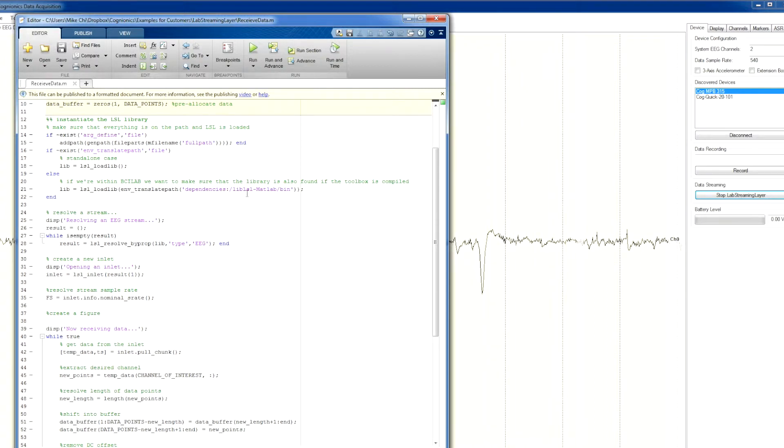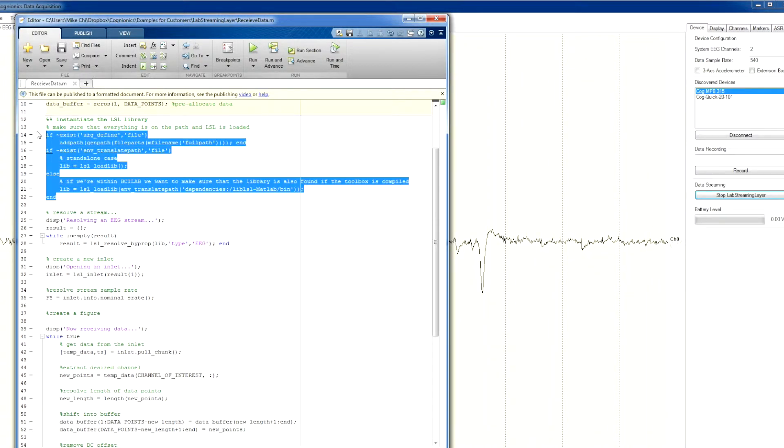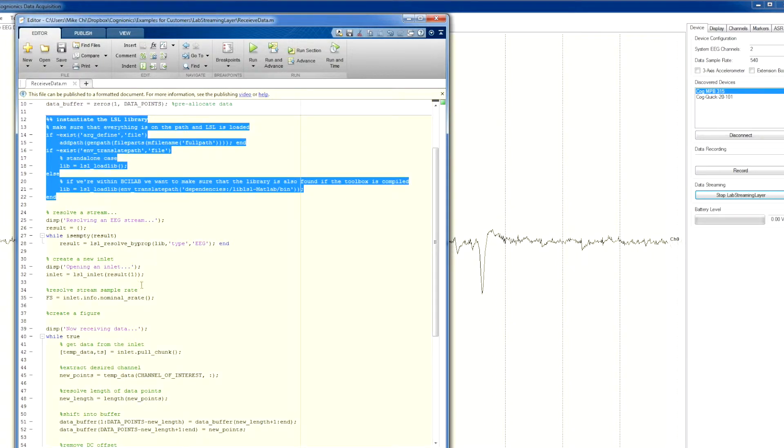The top of the script instantiates the Lab Streaming Layer library. It only takes a few lines and doesn't require any complex installations.